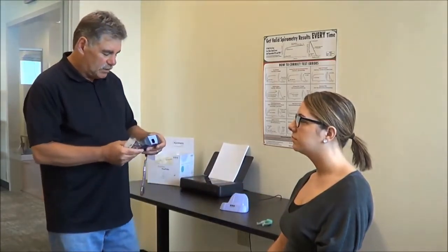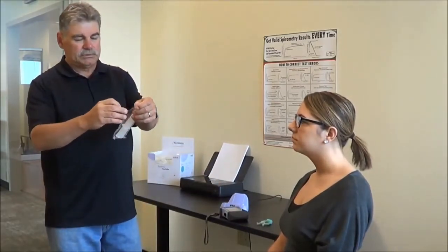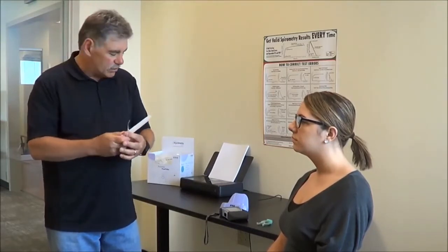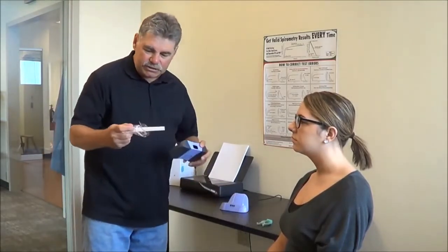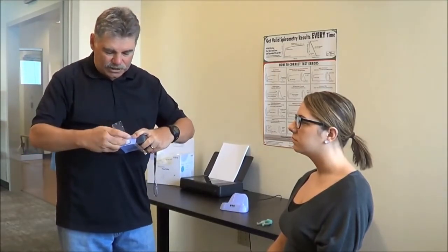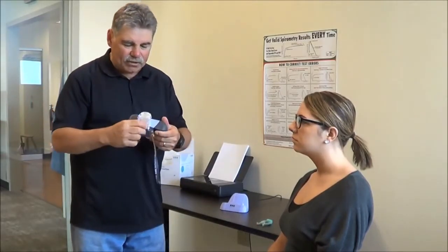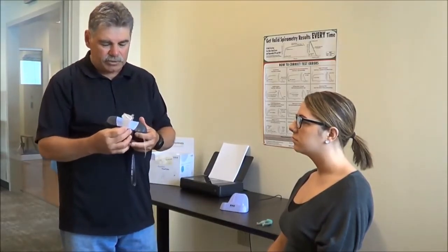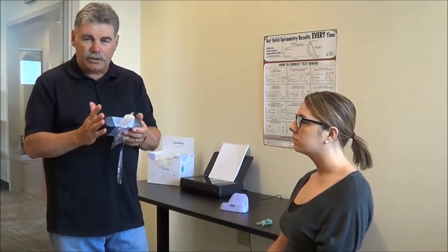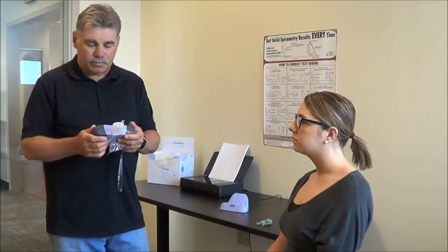We use a single patient use flow tube, we call it. The way we insert this is we partially tear the bag, insert the tube lining up the arrows there. I'm going to leave this bag on there because there's a step where I must block the mouthpiece before the first blow. So I'm going to leave the bag on there to keep that clean, but also to block the mouthpiece.